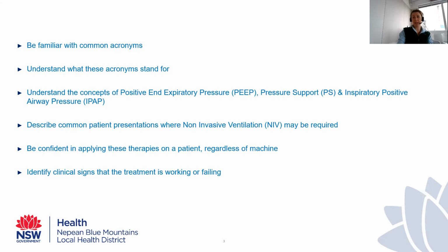Yes, you need to learn where the buttons are. Yes, you need to learn how to dial up your oxygen or set your pressures. Yes, you need to know how to troubleshoot alarms and what various alarms mean. But again, the core principles with these therapies are universal across the board.